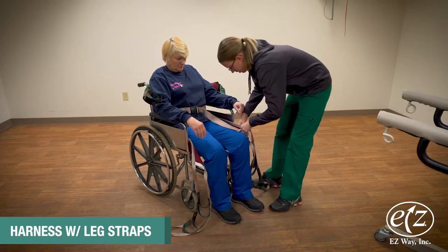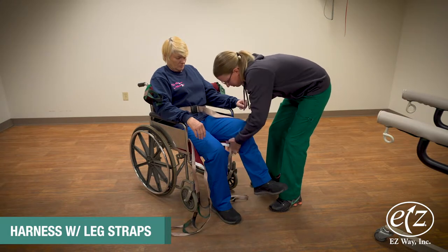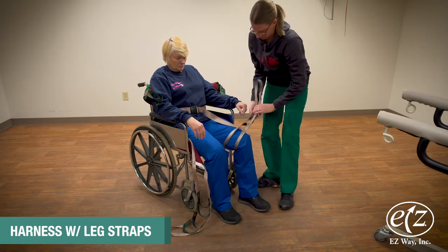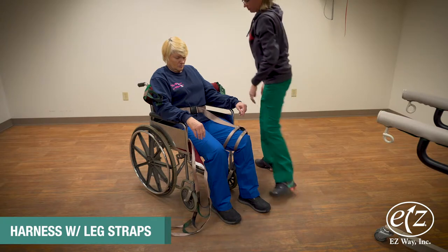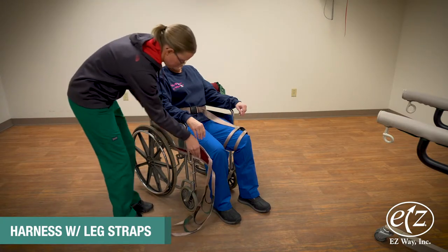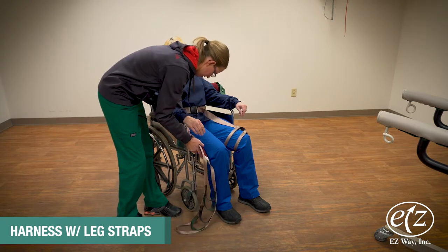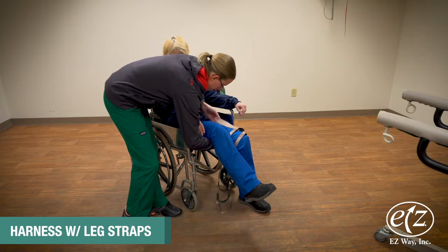With one hand, guide and tuck the leg strap around and slightly under their thigh. Then while raising their leg slightly, tug the leg strap under their upper thigh and rest the strap over their knee. Repeat on the other side.